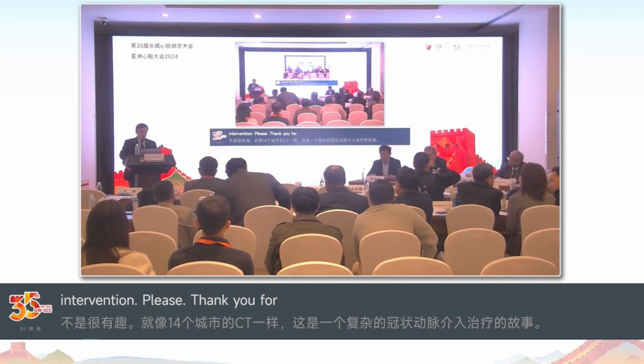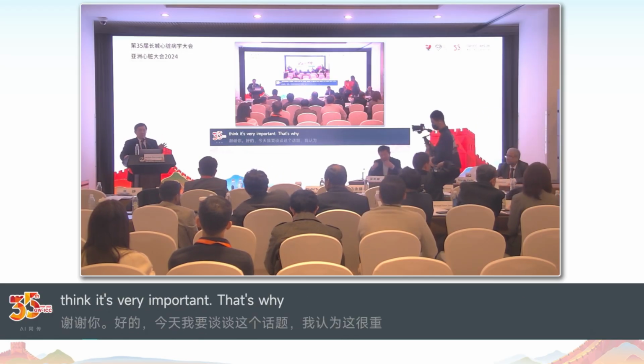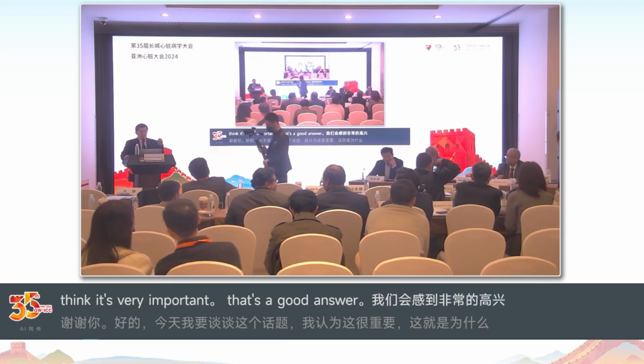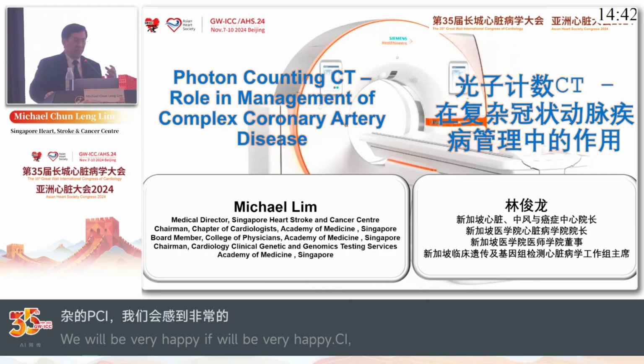Okay, today I'm going to talk about this topic, and I think it's very important for cardiologists if you're going to do complex PCI in terms of getting good long-term results and minimizing complications. You actually need to understand what's happening in the world of imaging.